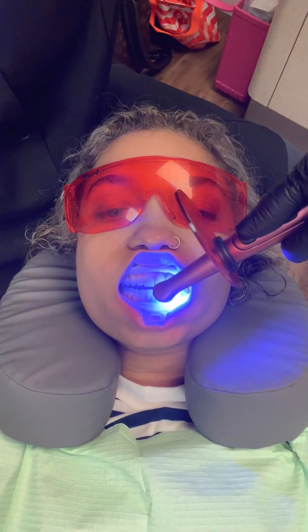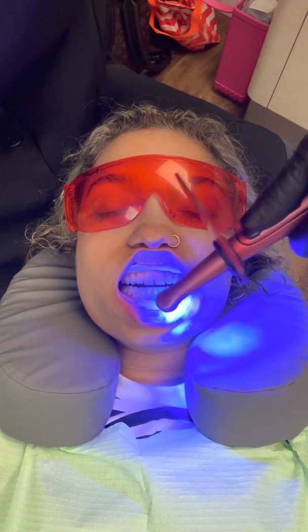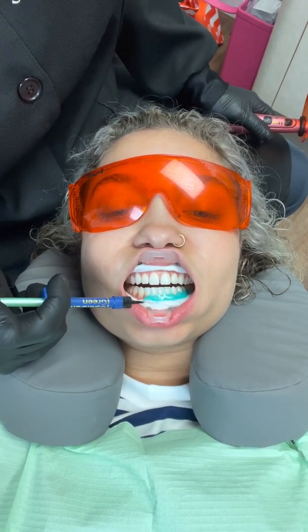Notice I'm just attaching the barrier — taking my time. This is where you really cannot cut corners, because even if Haley gets a great result, which we know she will, she won't like me very much if we burn her. I always tell patients that this is what's going to take the longest. Once we get everything on, we're smooth sailing. But right here is where we see a lot of team members not taking their time making sure there's no tissue showing through that barrier. Notice too that I have a different, larger tip on so I can extrude out more material.